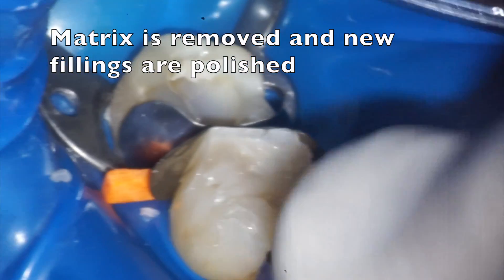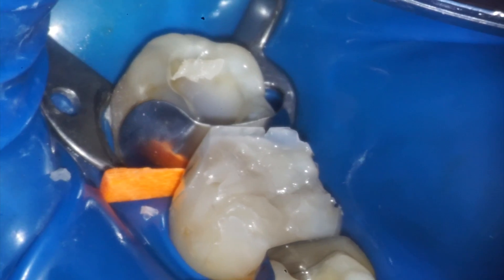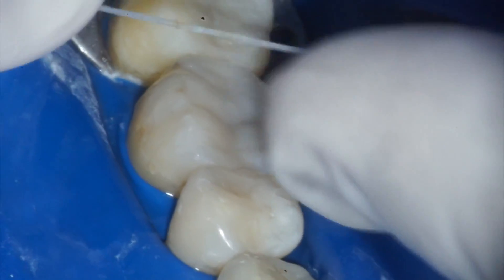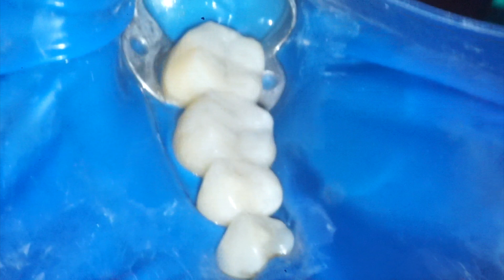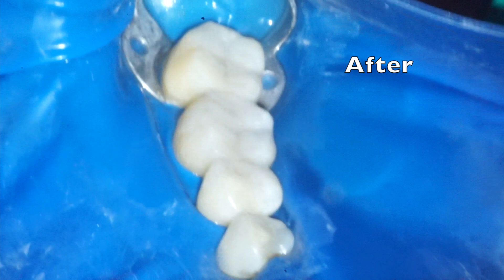The matrix is removed and the new fillings are shaped and polished. Here we are doing a final check with floss — we can see the fillings are smooth, with great natural contours and contacts. And here is our great looking final result: this is where we started off, and this is where we ended up — a really beautiful final result.